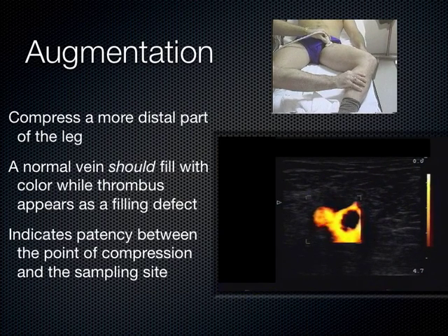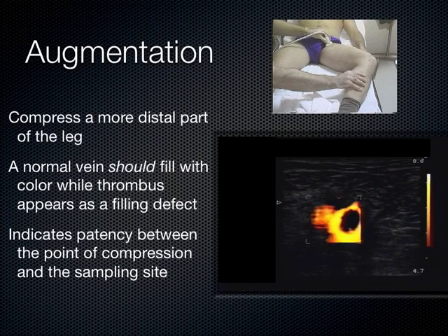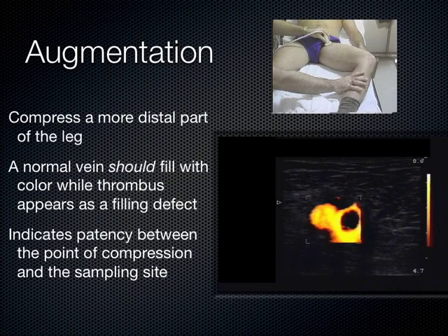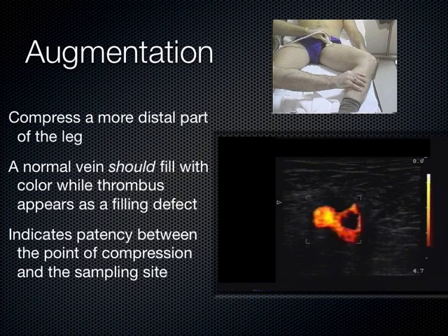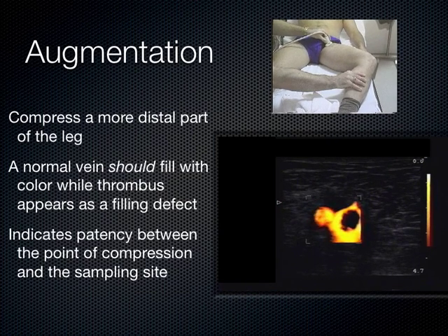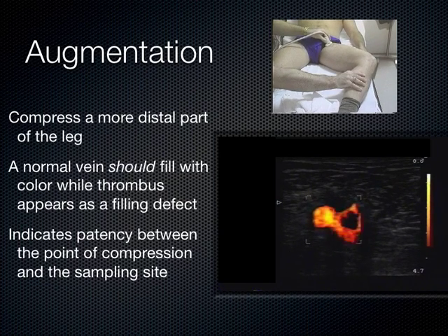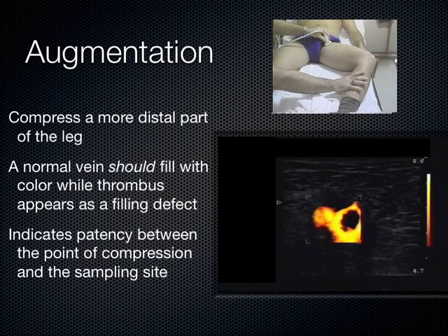It's a fun thing to do. I do it all the time. It's sort of a geeky ultrasound thing I love to do, but I can't rely on it. It's really only the grayscale compression alone, the 2D ultrasound image, no color involved, that rules in or out the DVT. There are lots of other color techniques that don't stand up under clinical conditions, and so you can't really use that. Even though today we'll probably be doing it because it's fun to see the anatomy link up that way. I think that's cool to show you, but diagnostically it's not useful.